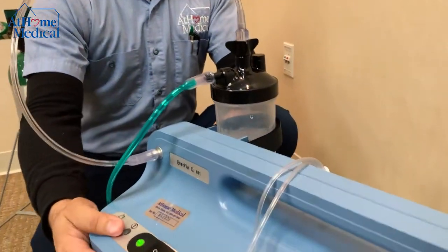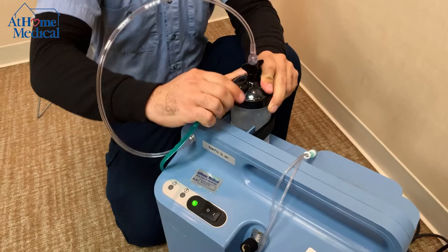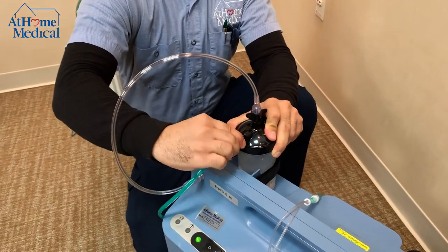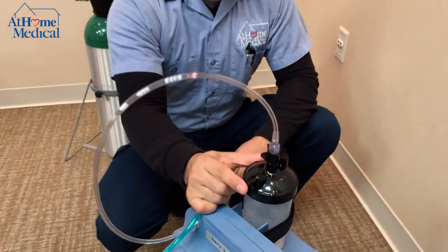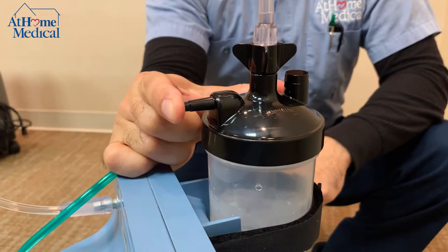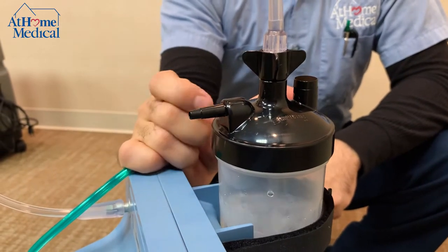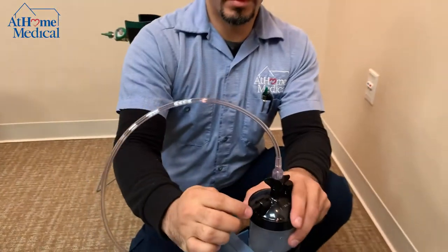If you want to make sure oxygen is coming out from the unit, you can disconnect your tubing on the bottle and simply put your finger over the output. When you let go, you'll hear a burst of oxygen coming out, confirming all connections are on correctly.